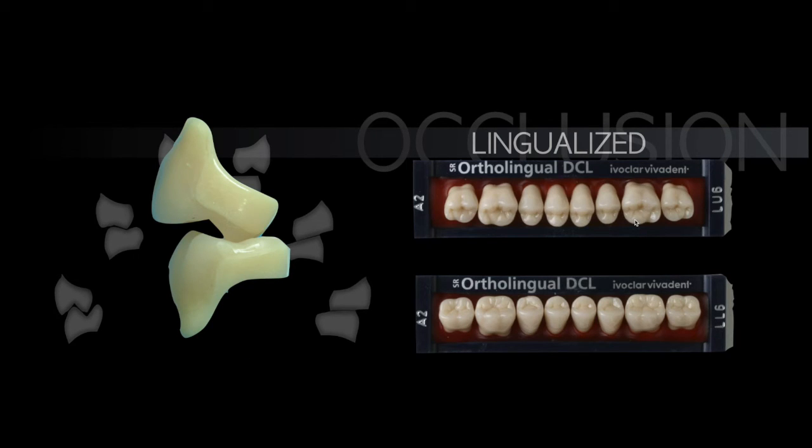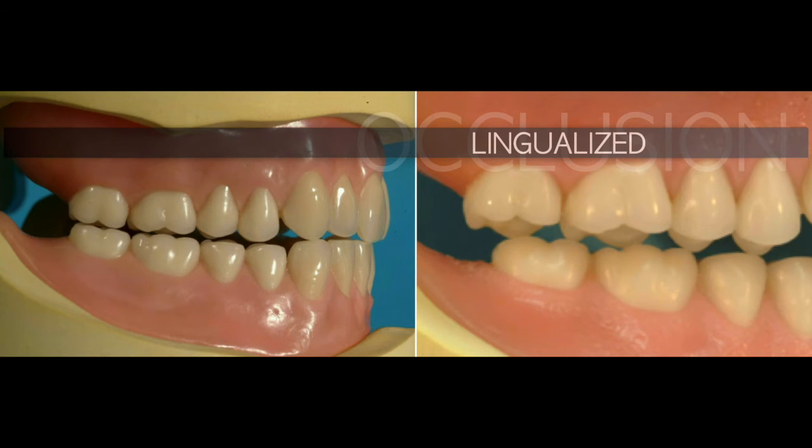In prefabricated denture teeth, you could identify whether the teeth mold is for lingualized occlusion by looking at the teeth. That means these teeth are manufactured for the lingualized setup. Same thing on the mandibular teeth, and this is showing you the mandibular lingualized teeth setup. So even in the lingualized occlusion setup, the bilateral balancing should still be achieved and established during the manufacturing.